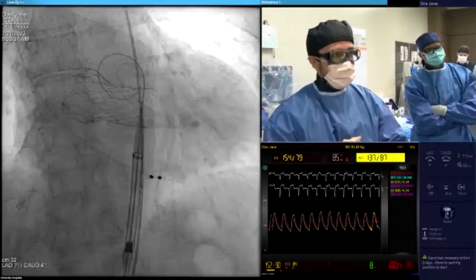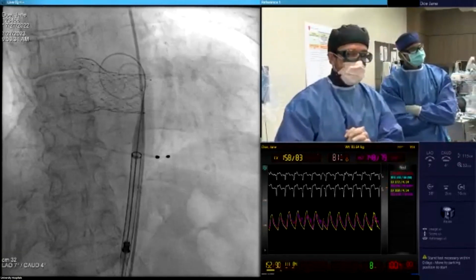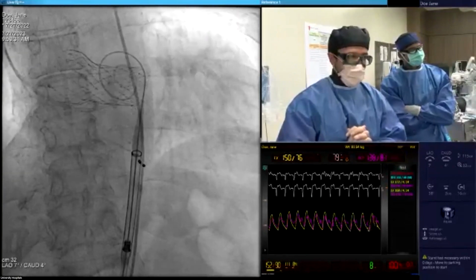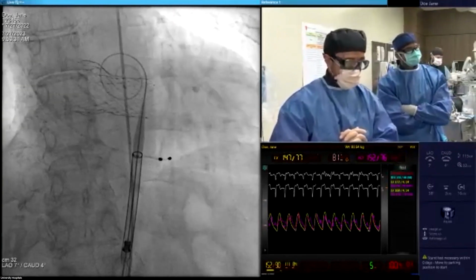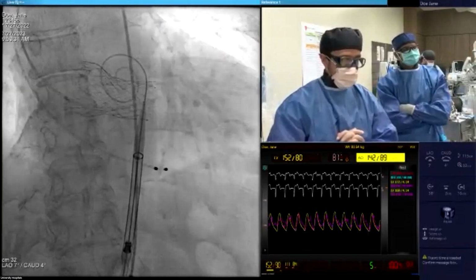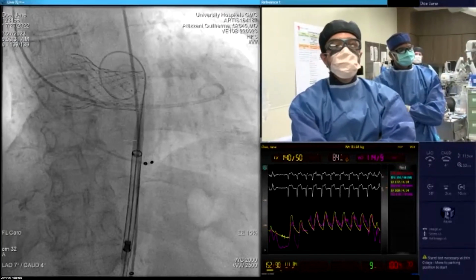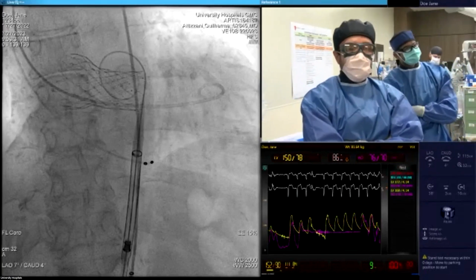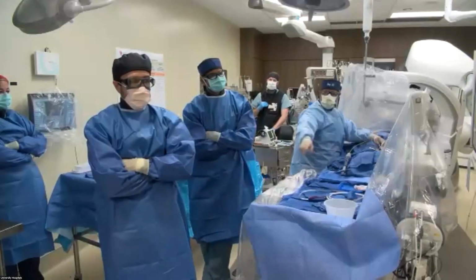I think this was a great example. If you want, maybe we can come back for a couple of minutes to show the cannulation after we do the next case if you want. If not, we're okay. And so this was a great example of treating a bicuspid. And I think that, looking at valve choice, this worked really well. And I think we've seen before that different devices, as long as you're comfortable, you have great skill set, and nice example of how to handle a horizontal aorta with an Evolut FX. So this is a great example of a case.